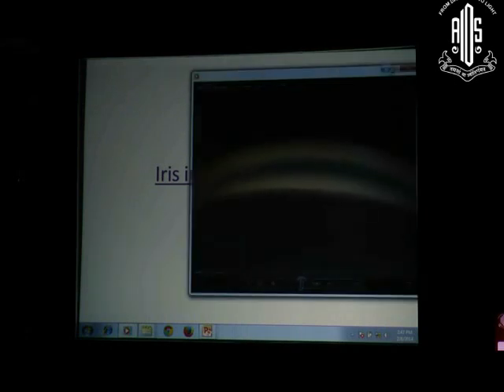The other important thing is to identify the presence of dense peripheral anterior synechia. You will see a central area where the scleral spur and trabecular meshwork is visible; on either side, the iris has gone and blocked the trabecular meshwork. This is a typical picture of chronic angle closure glaucoma — some areas may remain open but the iris is now completely plastered onto the trabecular meshwork. This is the hallmark of primary angle closure disease: peripheral anterior synechia causing occlusion of the angle structures with rising intraocular pressure.